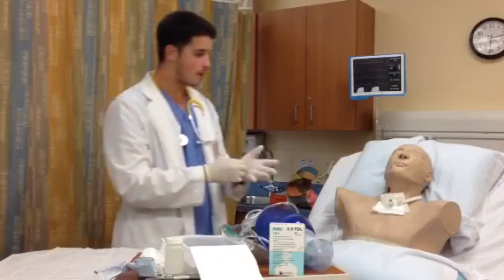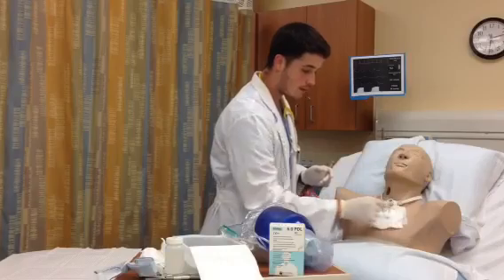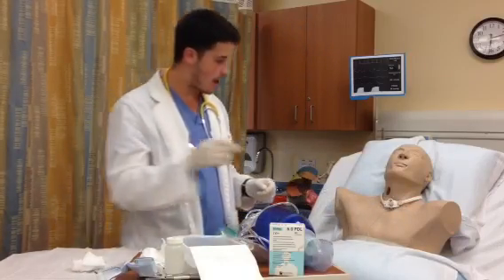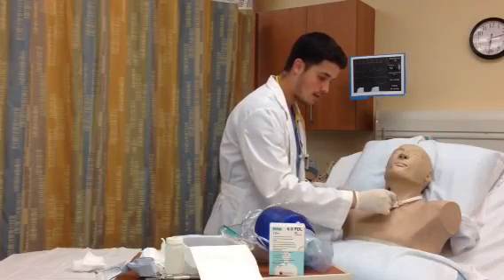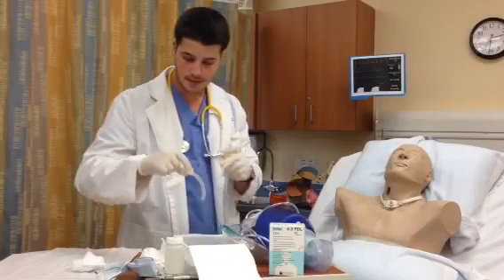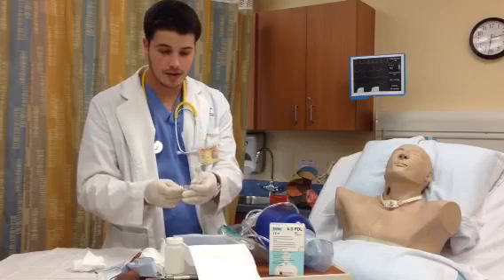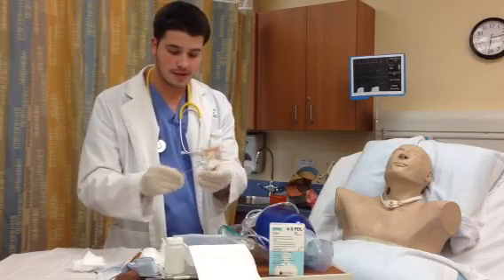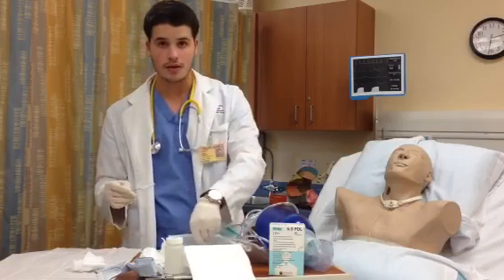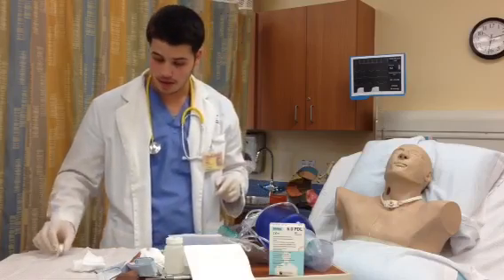Now, I'm going to remove his old pre-cut 4x4 gauze and his inner cannula. And I'm going to dip it into the hydrogen peroxide and then scrub it with the brush inside and out around the crevices. Dip it again into the other hydrogen peroxide. Then the sterile water. I'm going to tap it, and then I'm going to set it up here to dry.